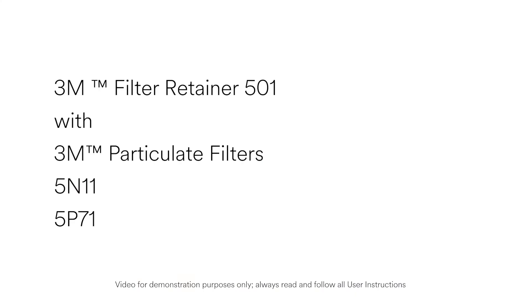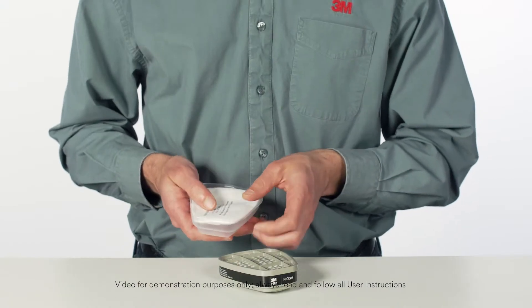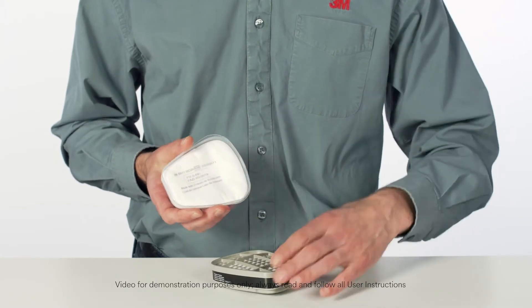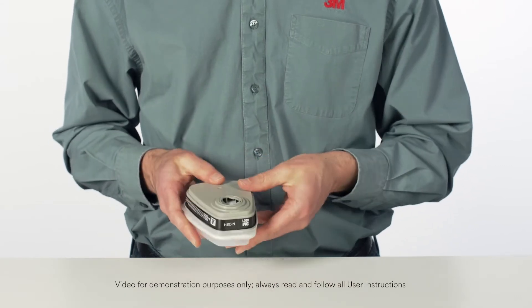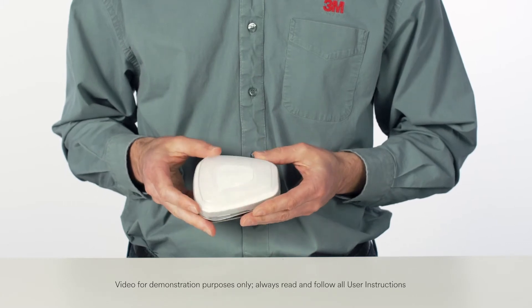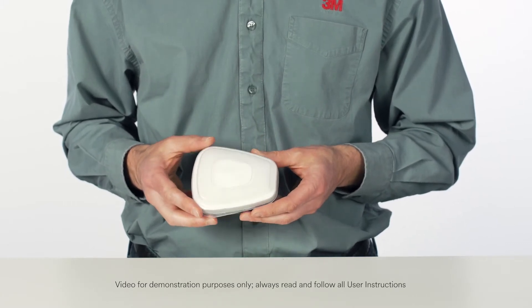To attach 3M Particulate Filters 5N11 or 5P71, place the filter into the 3M Filter Retainer 501 with the printed side facing away from the retainer. Press the filter into the cartridge until it locks securely. Correctly installed, the filter will completely cover the face of the cartridge with the printed side facing the cartridge.